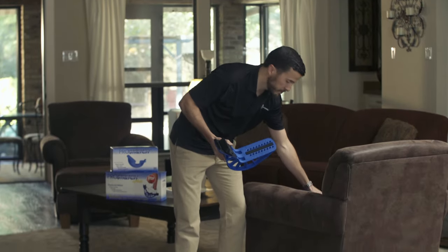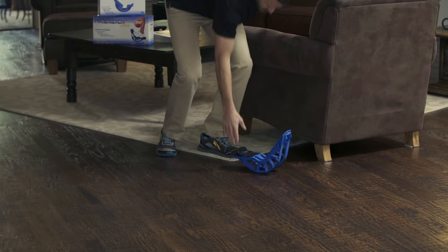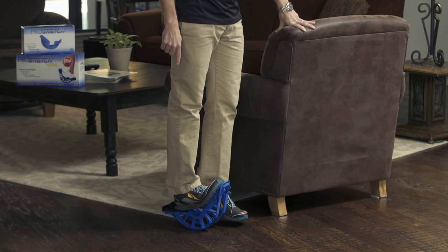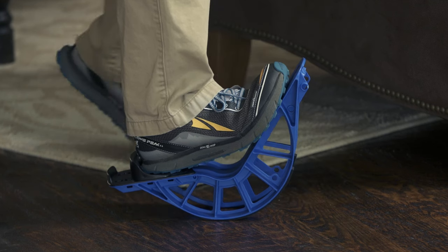To use either one of these products, set the product on the ground and stand next to a chair, a bookshelf, or a wall. Stand all the way up on the product — make sure you're not hunched over, your knee is straight, and drive your heel straight into the ground. Hold this stretch for about 20 seconds, both legs, two to three times per day.